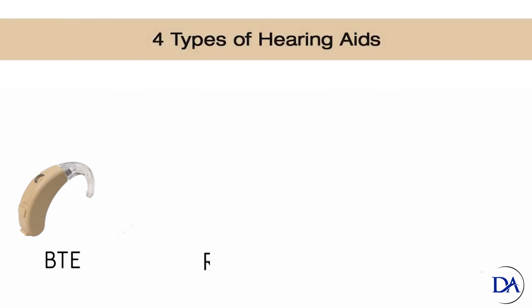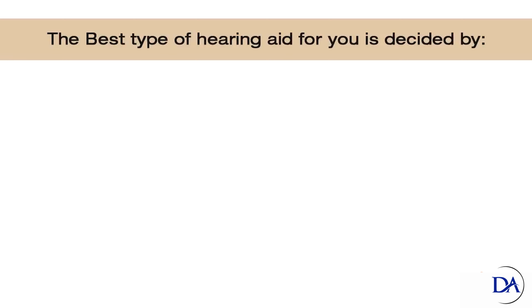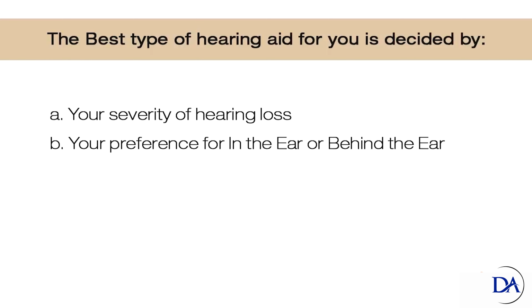This video is about the 4 hearing aid types. The best type of hearing aid for you would be decided by A, your hearing loss or severity of, B, your preference of type, would that be in the ear or behind the ear, C, your lifestyle, are you still very active or a homebody?